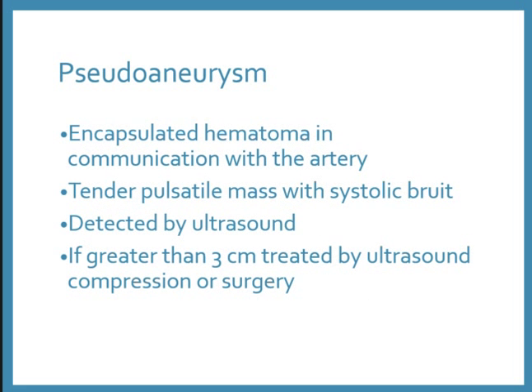A pseudoaneurysm is an encapsulated hematoma that's in communication with the artery. It's a pulsatile mass, may have a bruit. It can be detected by ultrasound, and if it's greater than 3 centimeters, it may be treated by ultrasound compression or surgery. I actually had a patient with one of these one time, and 2 hours into it, we got an ultrasound. They said there was a pseudoaneurysm. I think we ended up holding pressure something crazy like 4 hours, and I am not over-exaggerating. It was actually 4 hours.